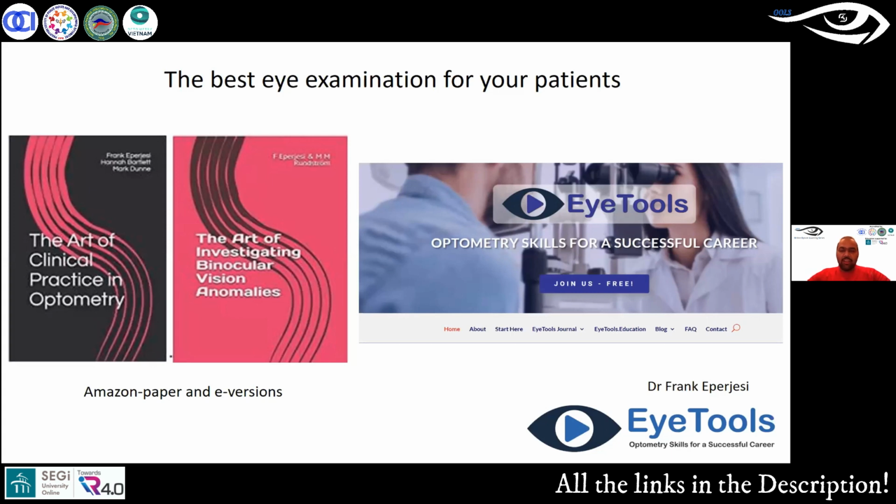I think these tests, the modified test, and some of the techniques you just shared are really the need of the hour, because with the direct ophthalmoscope used to see the fundus, now because of COVID, we are not going close to the patient. Doing the modified version would probably give us a better idea if we don't have fundus photography or a fundus camera in our practice. With a 20D lens, we are quite far from the patient, and it's much easier for us to see, right?